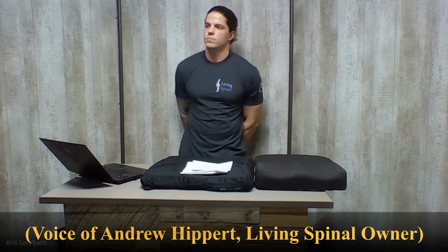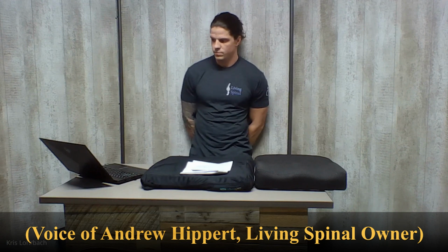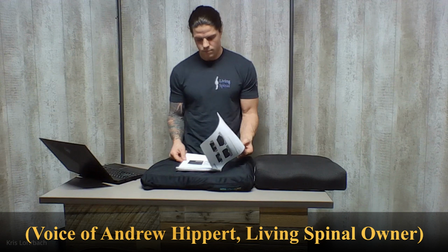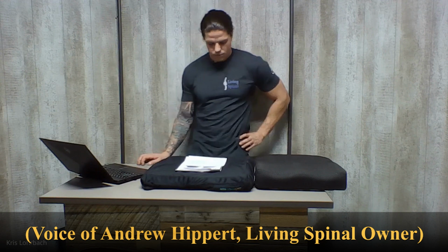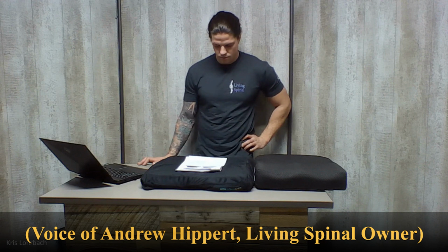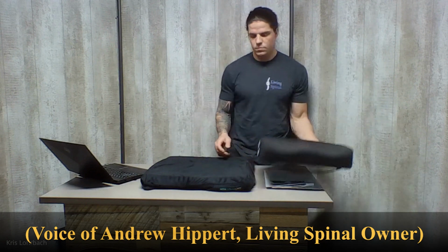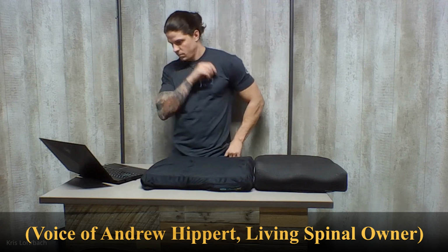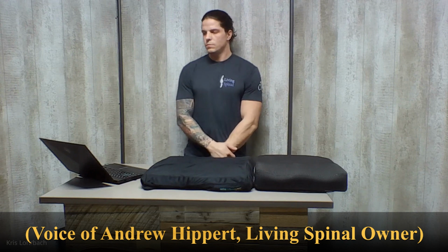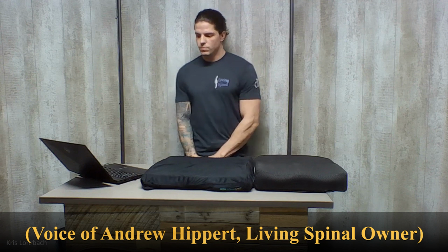The activity level of the customer, and their amount of disability. If they're elderly or maybe quite able-bodied, or they're just really active, then they're going to have enough. A lot of it is also the amount of circulation that's going on in the body. So if you have a ton of circulation and you're really active and ambulatory and moving around, and you're using your wheelchair part-time because you have MS or something else, where you have times when you really need it but then you're walking sometimes, those people could totally handle a flat cushion and be really active and make it easier maybe to transfer and whatnot.